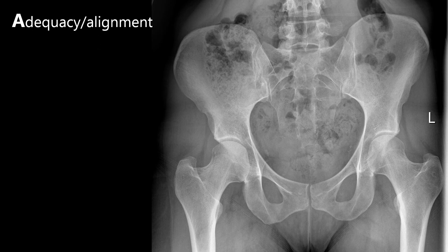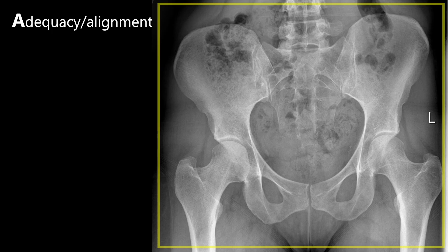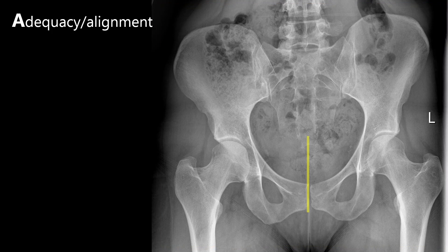First is adequacy and alignment, which is a quick assessment of the image quality. An adequate image means that we can see the entire pelvis, from the top of the iliac crests down to the femoral shafts. An aligned image means that we have the coccyx and pubic symphysis in the midline.